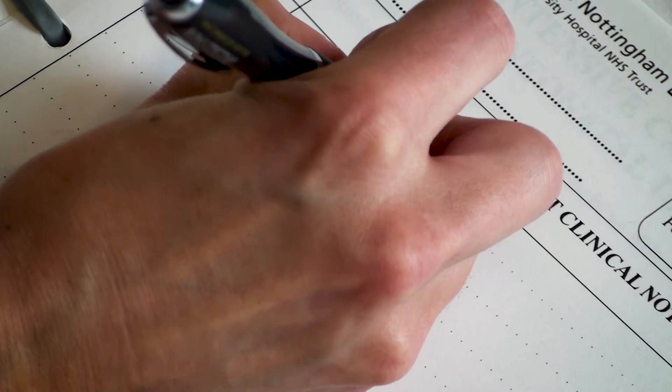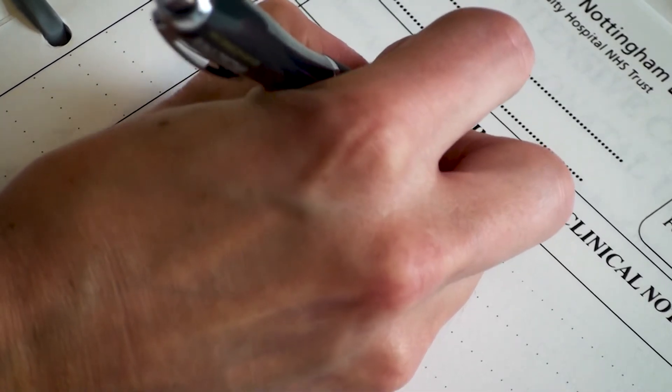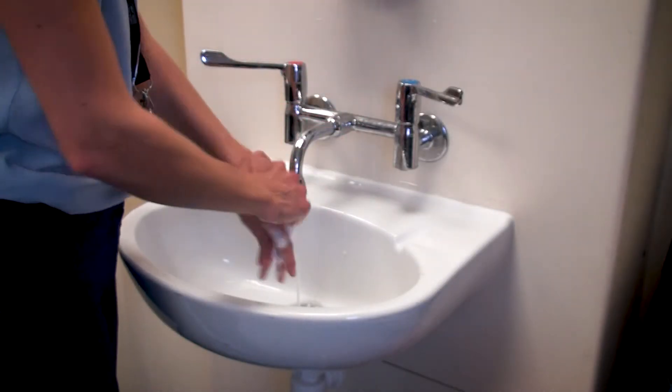Ensure any results out of range are responded to appropriately. Dispose of the lancet in the sharps bin. Explain the result to the patient and clear away all equipment and wash your hands.